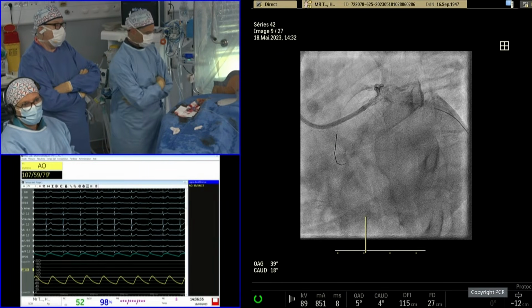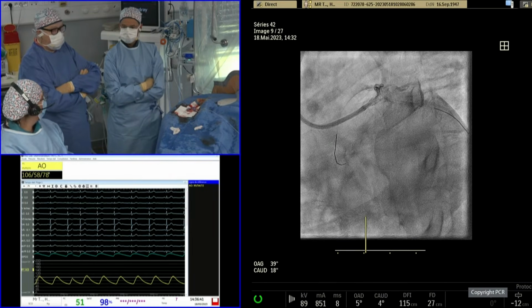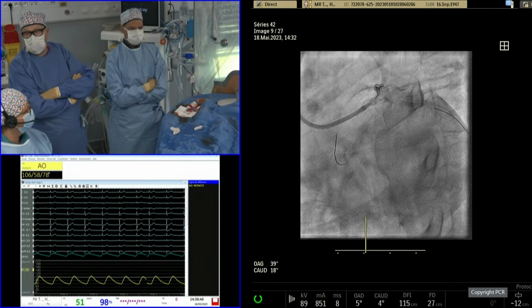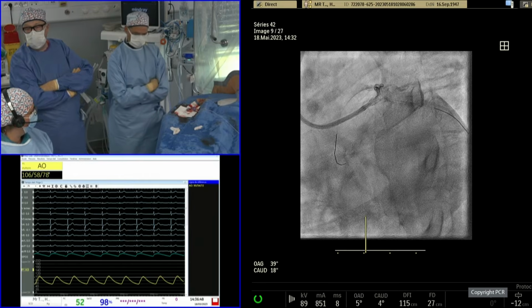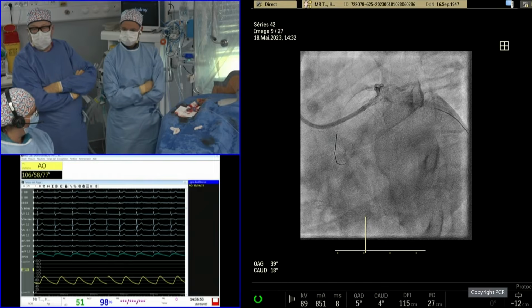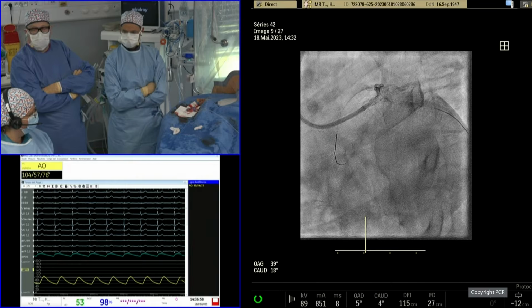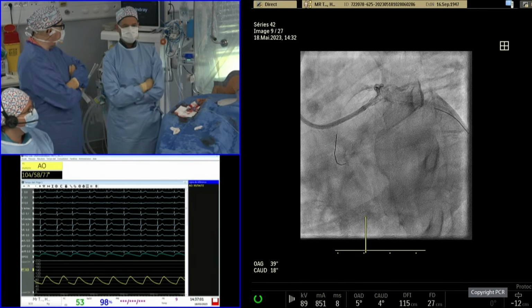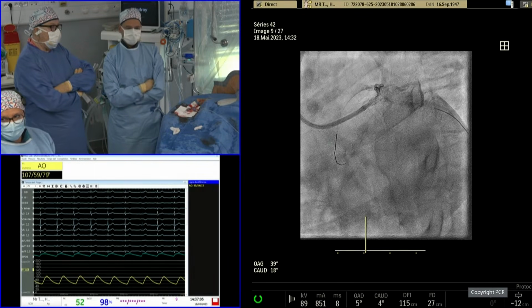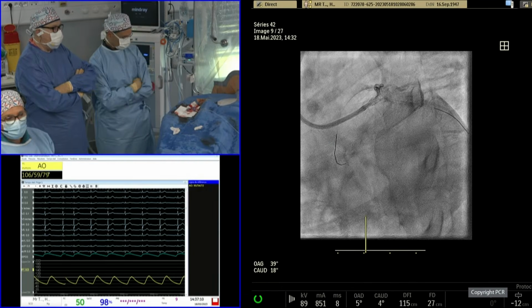Yes, I think it was a nice example of what we can achieve with a provisional stenting strategy with 2 different types of bifurcation, left main and non-left main. It's also a good example of the additional value of OFDI evaluation, and thanks to Yoshi for doing that. It provides very important information in terms of sizing, and for us it was also very useful. Congratulations. Thank you.